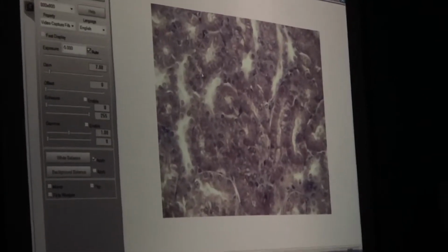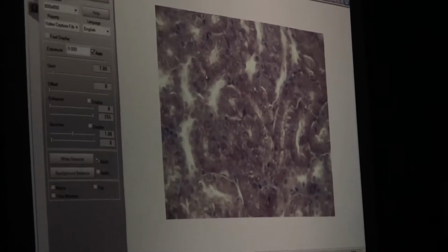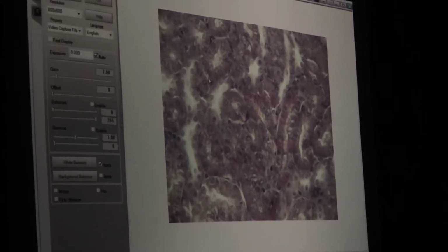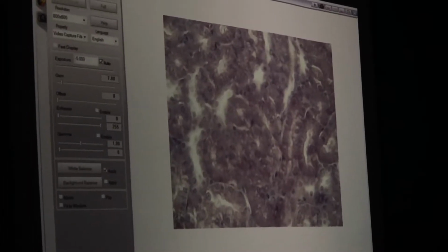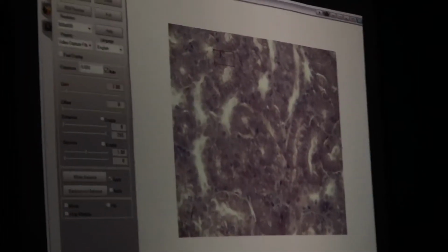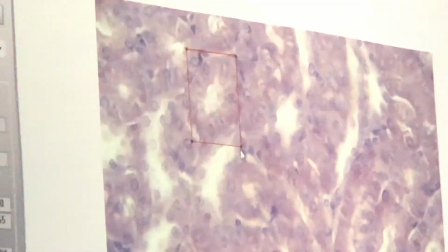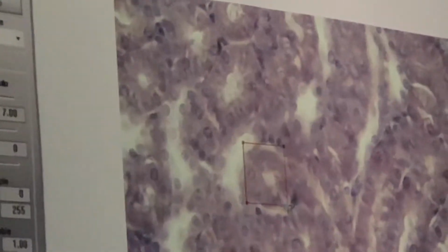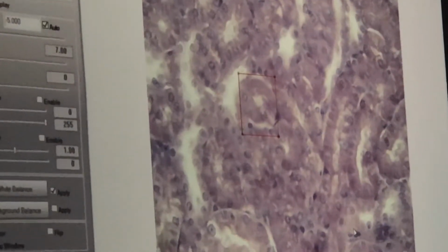If we could tell, what would we use to tell proximal from distal? Microvilli. Which ones have them? Proximal. Okay? So on a lab test though, any of these things, so if I put the pointer on this thing right here, convoluted tubule. If you wanted to write proximal or distal convoluted tubule, you certainly could do that, but we're not going to worry about differentiating them. Okay?